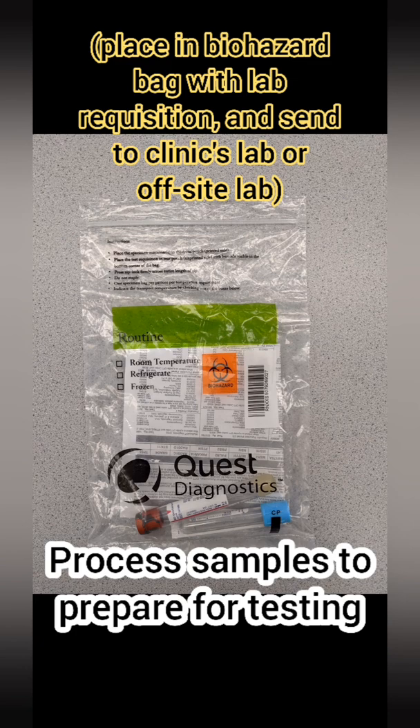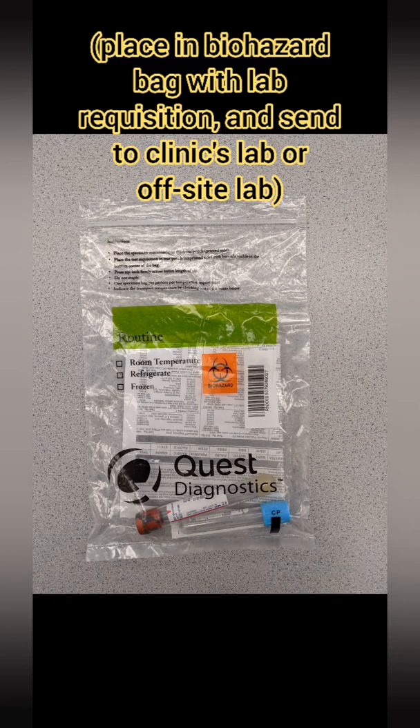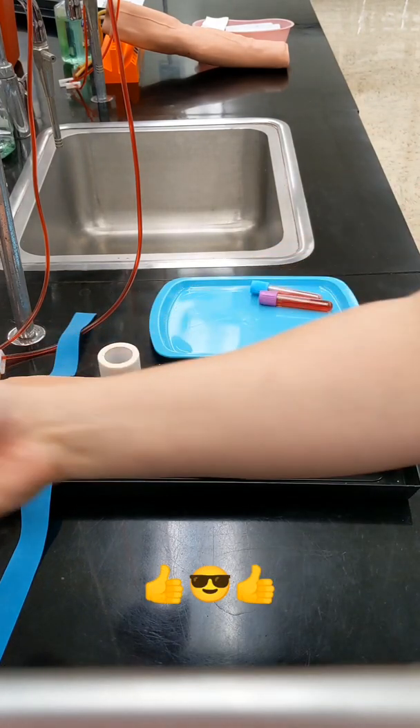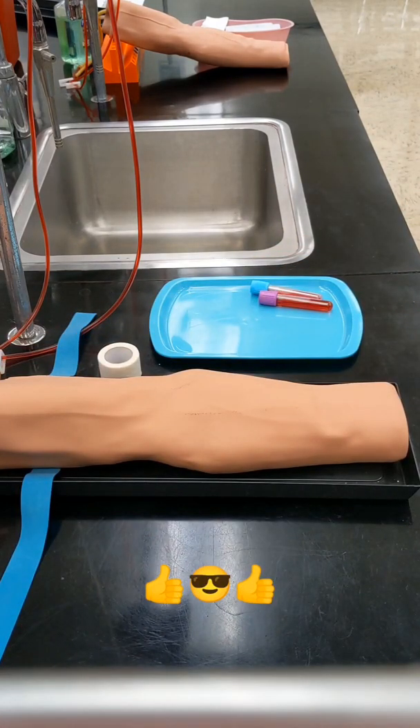When your patient has been taken care of, prepare your samples for testing. Put them in a biohazard bag with your lab requisition. You'll either need to walk it across the hall to the lab in your clinic, or send it off-site for testing.